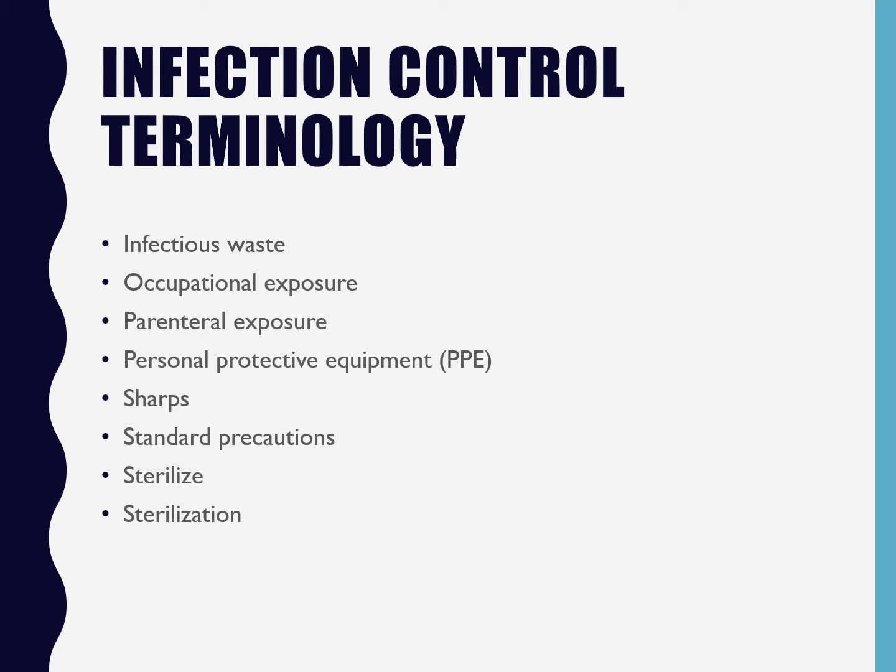There are two separate types of sterilizing that are used most often in dental settings, and one of them is the autoclave, which is a heat sterilization machine. You put it in bags, it sterilizes through heat, it kills all of those spores. There are all of those tests to make sure that the heat got up to the temperature that it was supposed to. The other one is a chemical. There are numerous chemicals that are those high level disinfectants that can, with the right amount of time, actually sterilize the things that are in them.